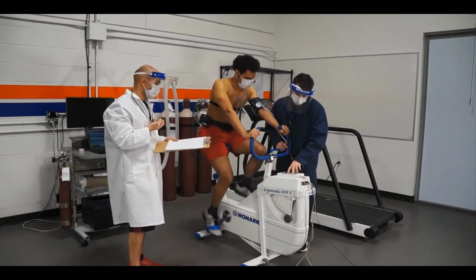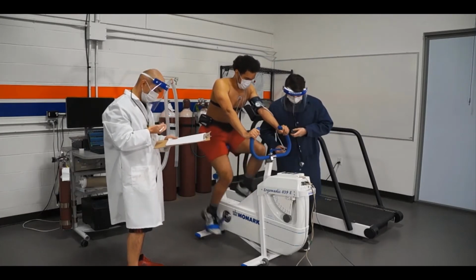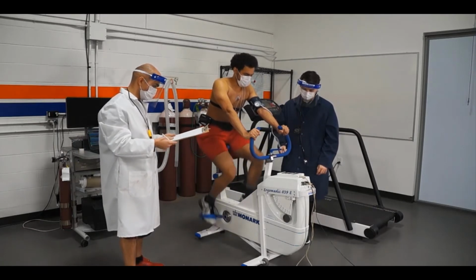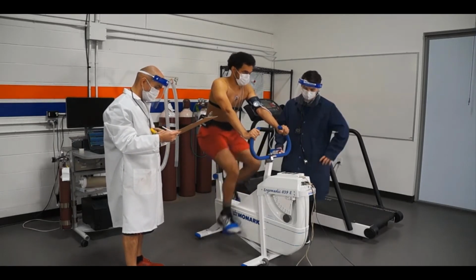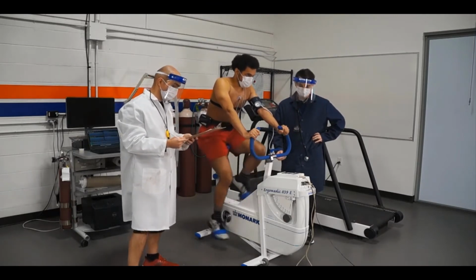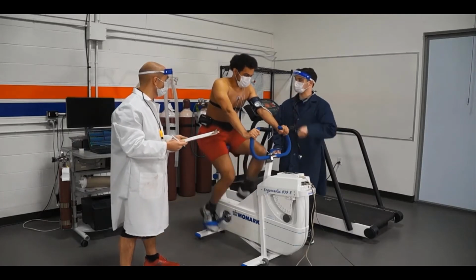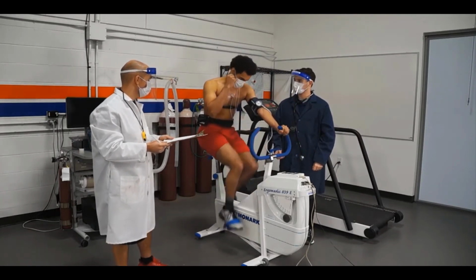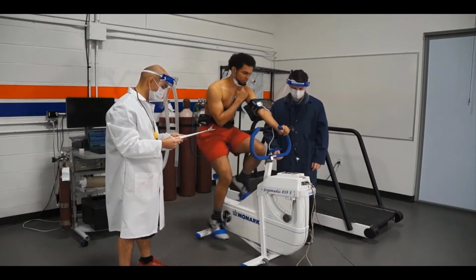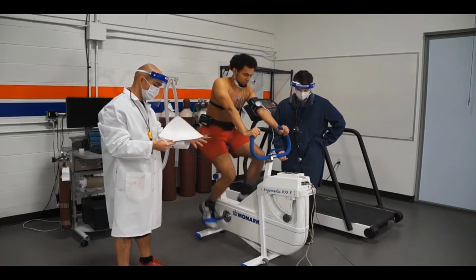So just making sure measures are good to start, having the participant start his warm-up. You can see there's some communication between the two experimenters. Myself and Nick sync our stopwatches. And he's got blood pressure cuffs on, so I'll be taking blood pressure. Nick will be recording RPE and heart rate at each interval. You can see he's also got a heart rate monitor on, so Nick will be checking either the watch or palpating and just double checking and referencing both those numbers against each other to make sure that he's getting the consistent numbers.